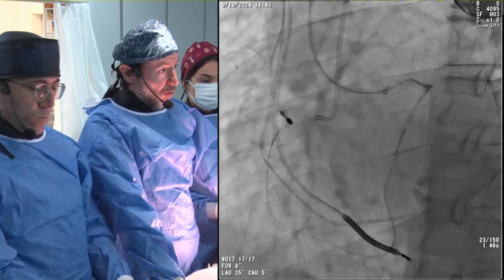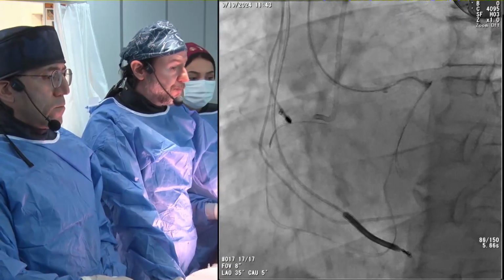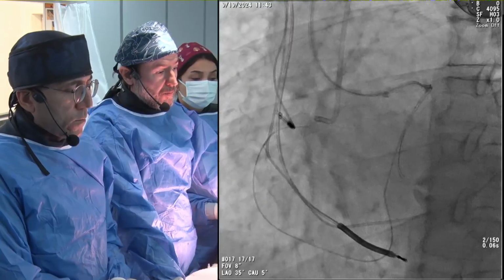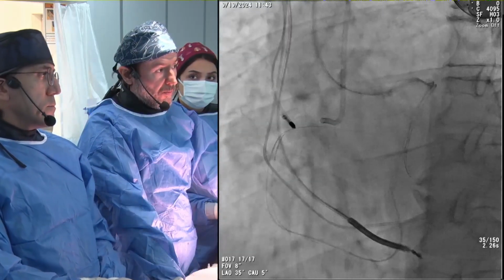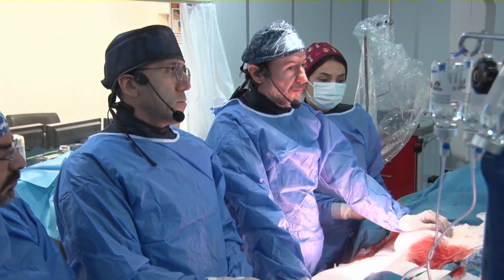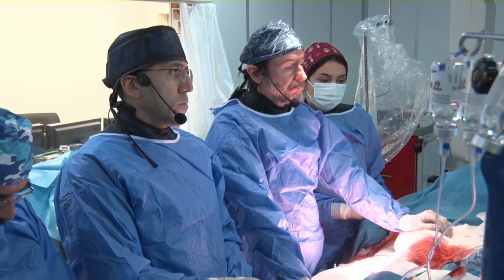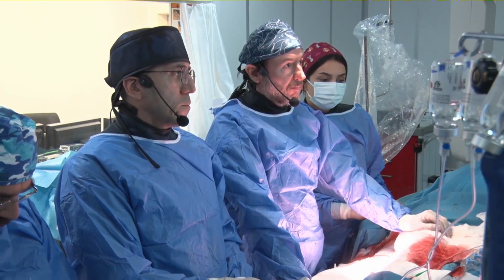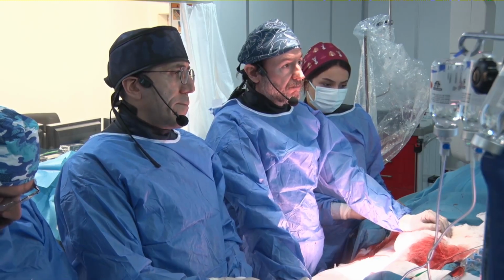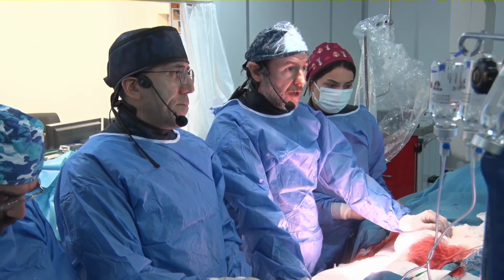Okay, let us work, and actually you have done a fantastic job so far. As you described, if you keep the knuckle wire just in front of the proximal RCA cap, then you can narrow down the antegrade puncture point. That is the only way to focus on the antegrade direction, in both the LAO and RAO cranial projections. Confirmation is necessary. Yeah, that's what we are advised. Okay, thank you very much.